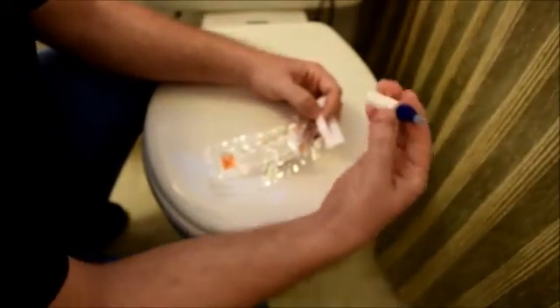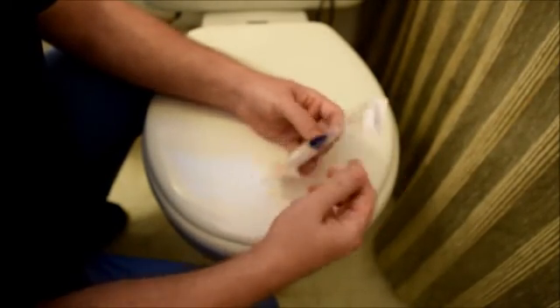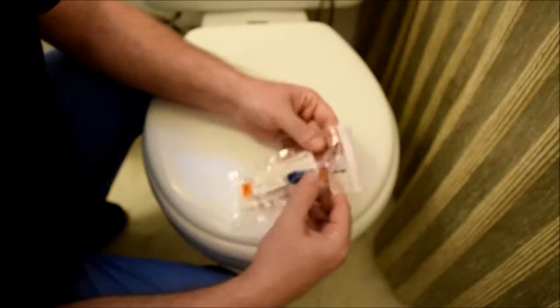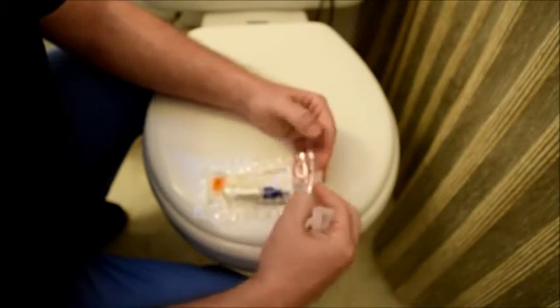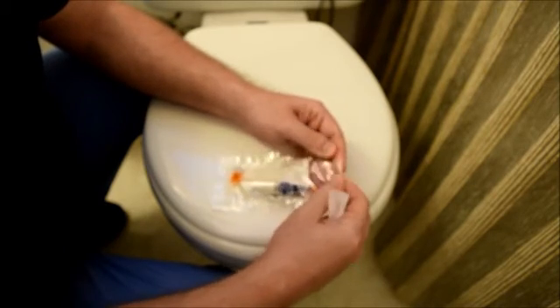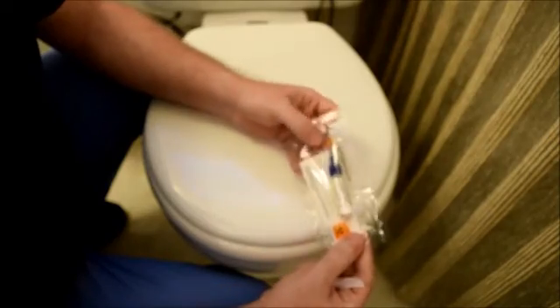You have your bio bag. Now that you've collected your sample into the collection tube, put it inside the bag. Make sure to keep the absorbent pad inside. Tear off the backing for the adhesive strip and go ahead and seal the biohazard bag. Now you're ready to return this to your physician or lab in person.